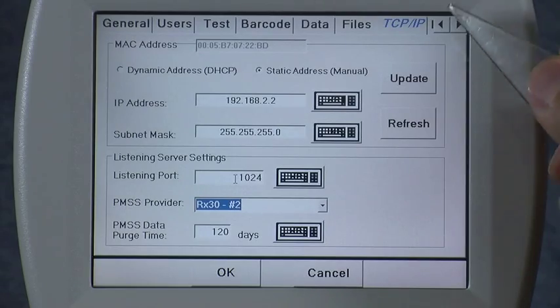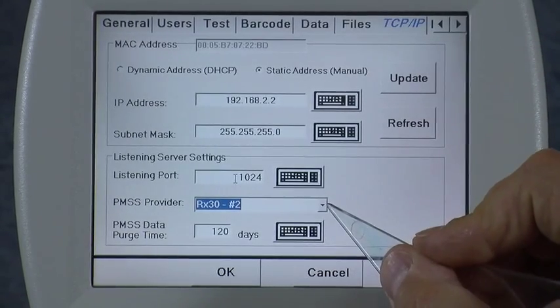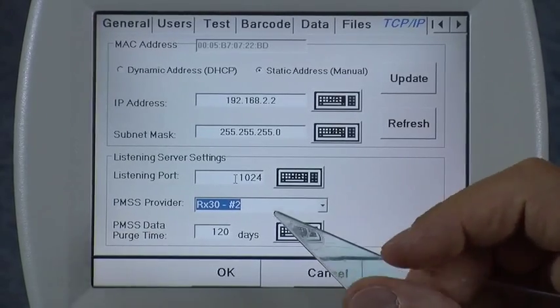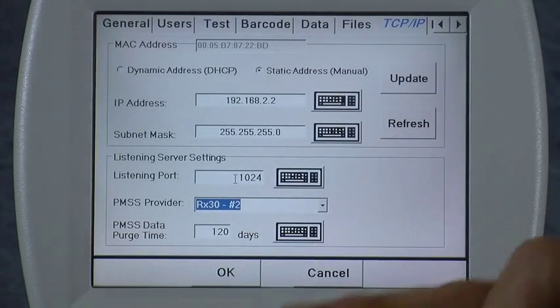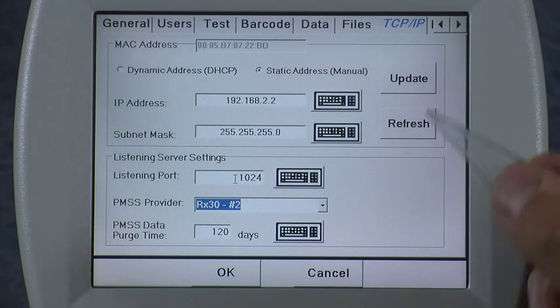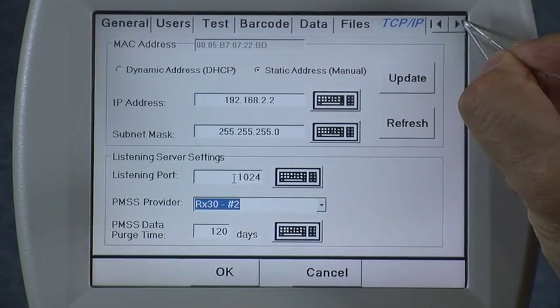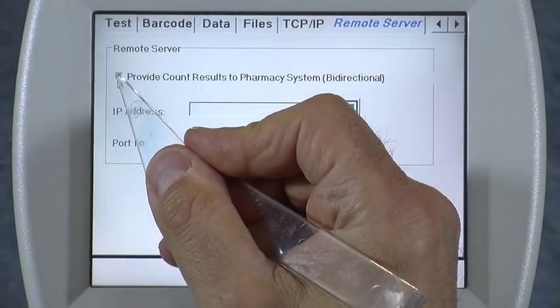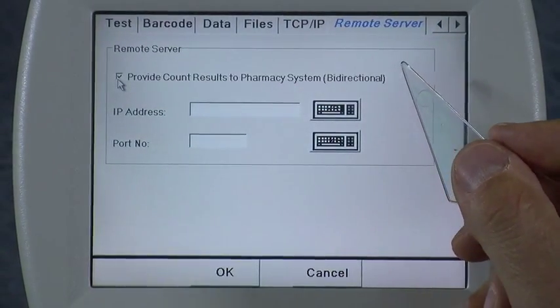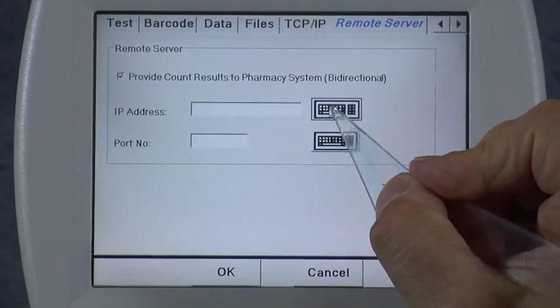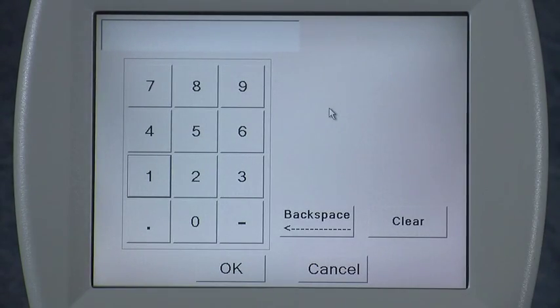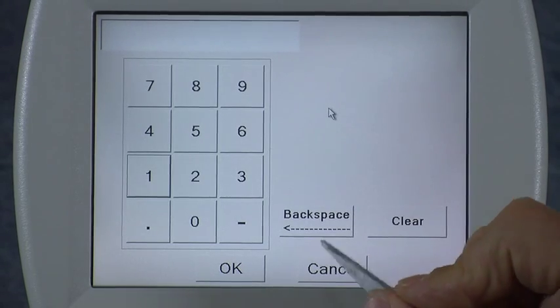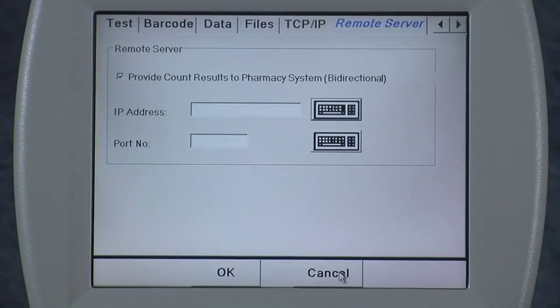This completes the TCP/IP tab. However, if you are doing an interface and your pharmacy software provider has the bi-directional interface with the icon — so they can receive the results of every prescription filled — you'll need to scroll right using the arrow button and select the Remote Server tab. Enable 'provide count results to the pharmacy system bi-directional,' then specify the IP address of the computer system the icon needs to send results back to, as well as their port number. Contact your pharmacy management software supplier to get that information.